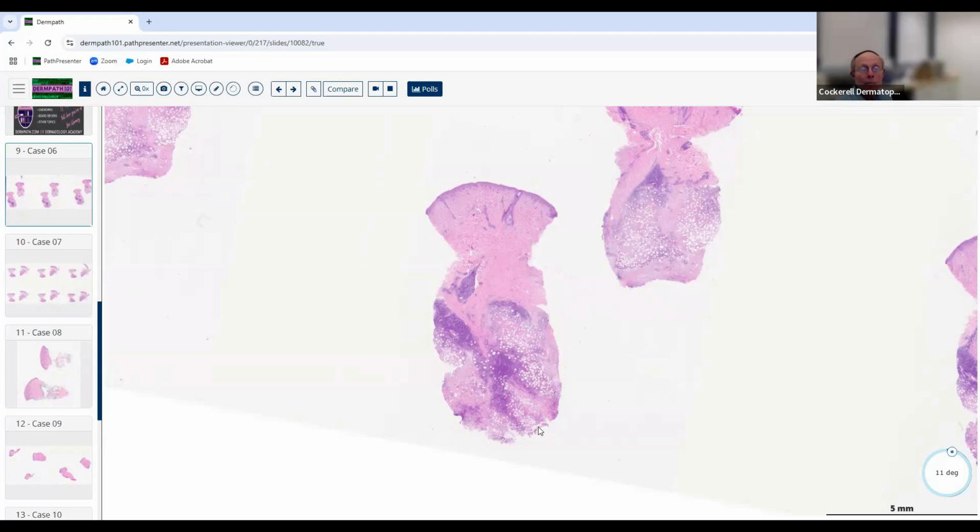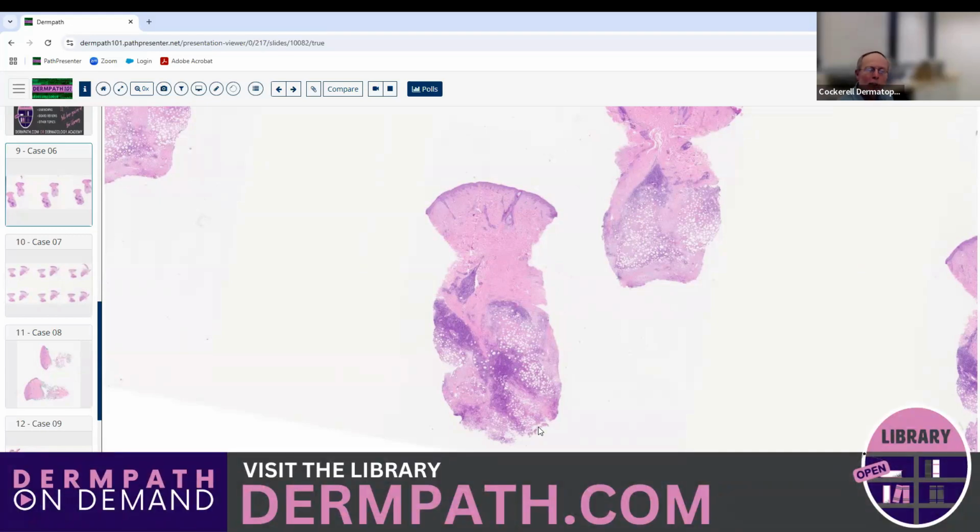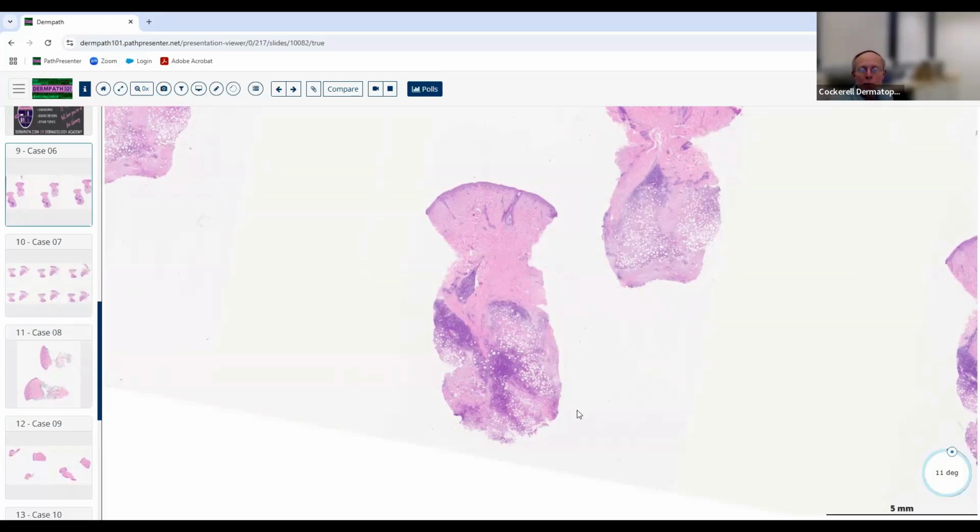Paniculitis is one of those entities where it's very formulaic. We have a very systematic approach. We ask ourselves, is it lobular versus septal? We say mostly septal versus mostly lobular, because there's always a little overlap between the two. Sometimes something can be purely septal, but if the septum is inflamed, usually there's some sort of periseptal inflammation too. So we say mostly septal or mostly lobular. At this power, we can see that the lobules are almost totally involved. The septa are probably secondarily involved, but it's a mostly lobular paniculitis.